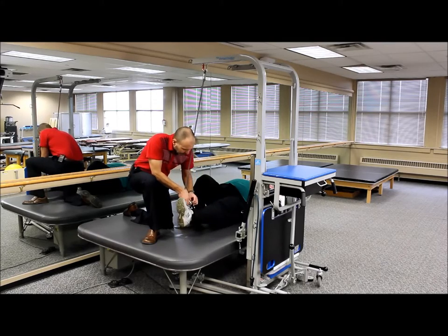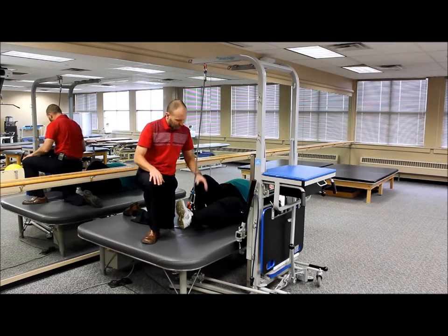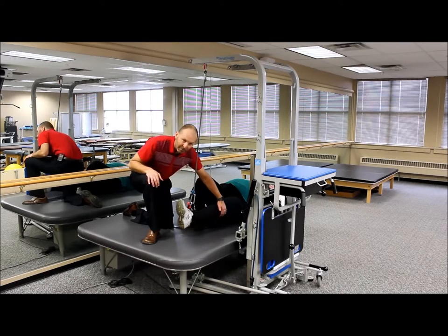So we're going to go ahead and lift the leg up and support it here, and we can adjust the height by sliding that rope through. And now we can provide a nice stretch to the back of the knee for our patient for several minutes if we need to.